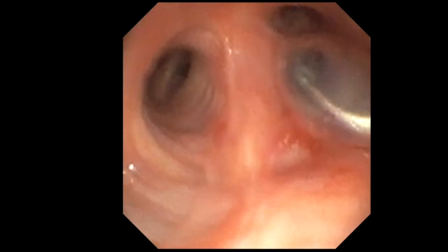In this case, a 4 French endobronchial balloon is placed in proximal RB2. The position of the balloon is then checked and one of the procedural assistants is entrusted with the sole responsibility of operating the balloon and to ensure it stays in place. The proximal end of the balloon can be taped to the rigid scope to facilitate the process.